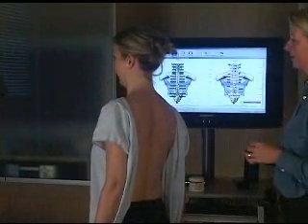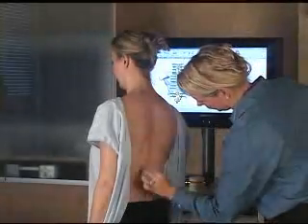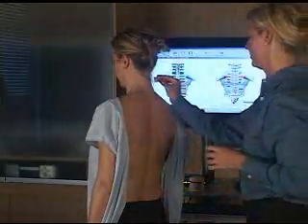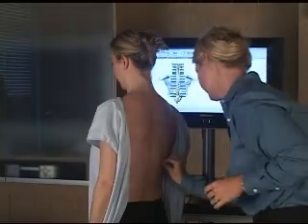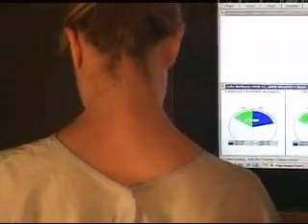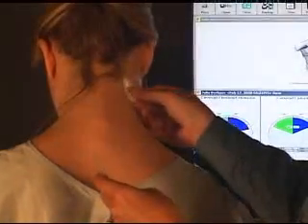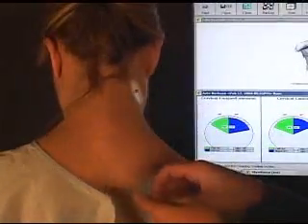So we wipe the skin with alcohol first, as always. Make sure it's dry by using a paper towel, perhaps, and make sure the skin's nice and dry before you attach electrodes. Here we're doing the full spine because we're going to do lumbar also. And what we do now is we attach the electrodes to the skin. You can put them on the device first, or you can place them on the skin first, whichever you're more comfortable doing. Here you can see we're at about C4.